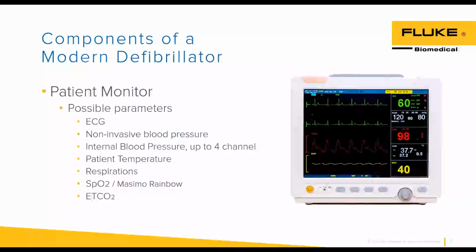And with modern defibrillators, obviously we'll need to use a defibrillator analyzer, but because there are these three really different devices working in one device, you might also need other test tools, maybe something that can measure flow, or of course patient monitor simulators. So with that, we're going to talk about the transcutaneous pacemaker.